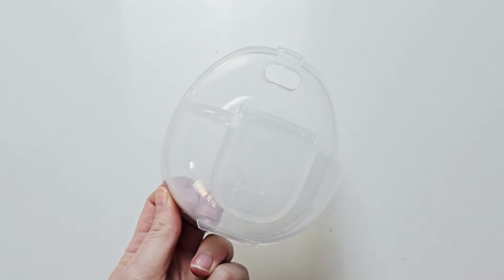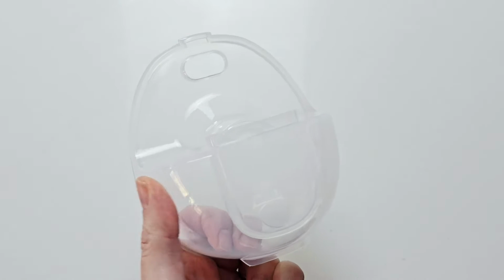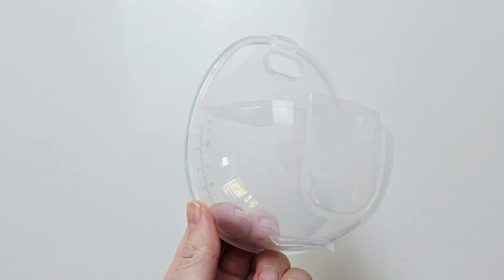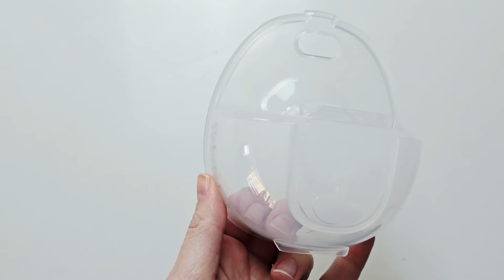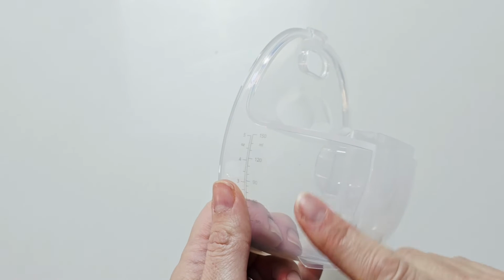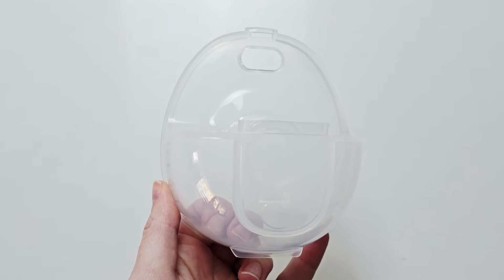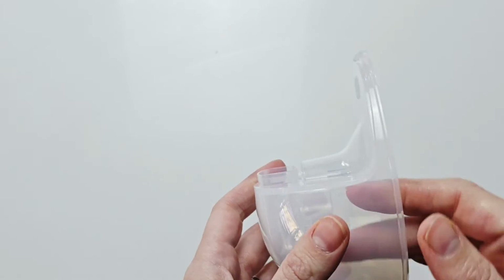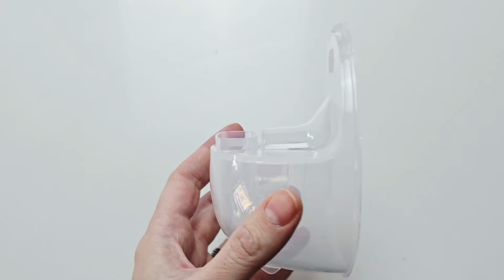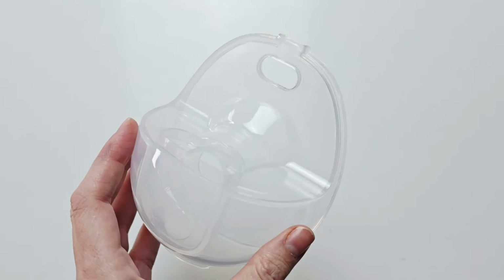Next, you have your collection cups. Now, these should not need to really be changed out very often. 6 to 12 months potentially, depends on usage. If you end up getting scratches or any damage, if you have any cracks, these need to get replaced. Scratches are a great place for bacteria to grow. So again, consider changing these out. And you might find that these start to get discolored, especially if you're using sterilizers and dishwashers. So again, over time, you might want to look to change these out. 6 to 12 months is a good rule of thumb.